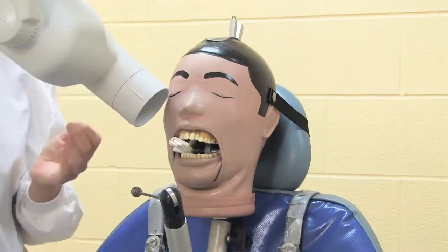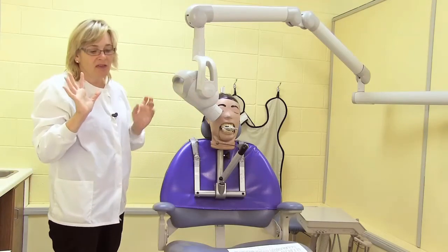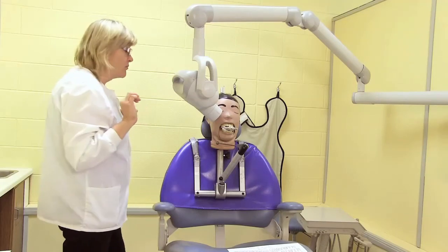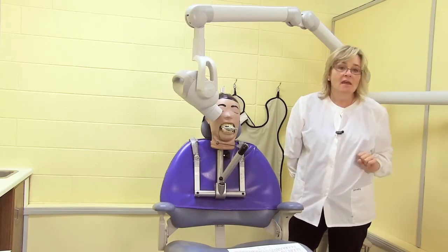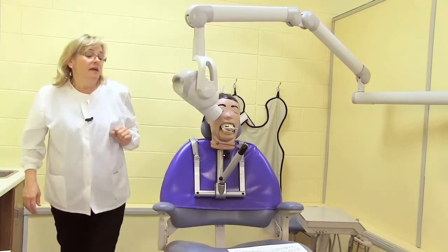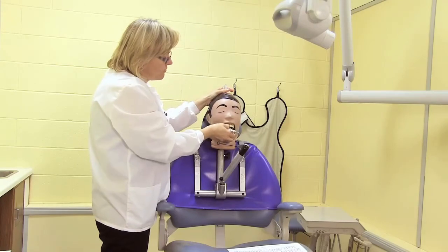And remember that when you have real clients. And because, again, the shallow palate and the film placement itself, I've increased the vertical angulation to approximately 37 degrees on this particular shot. Before I take my shot, I want to make sure I have the right setting. In this case, second setting is the premolar setting. Now our next shot and our final shot would be the molar shot.